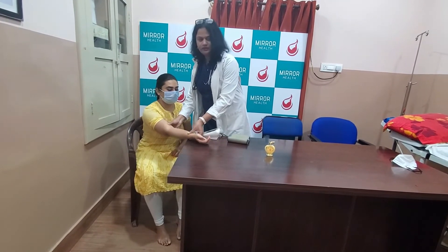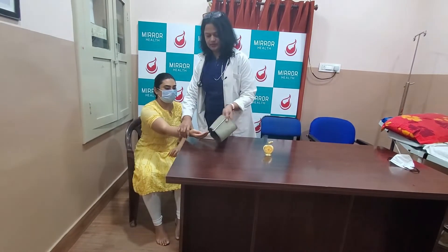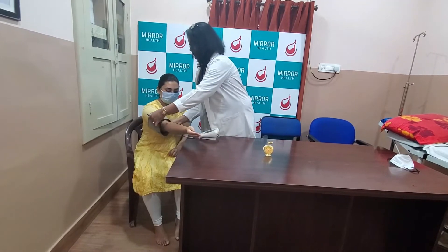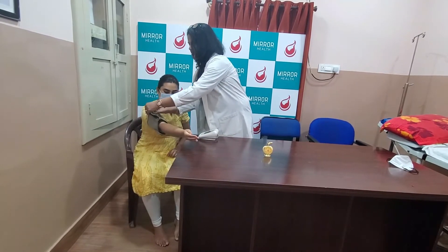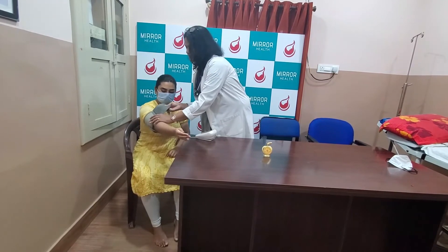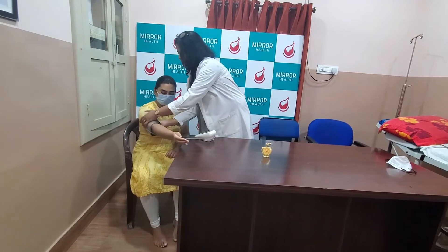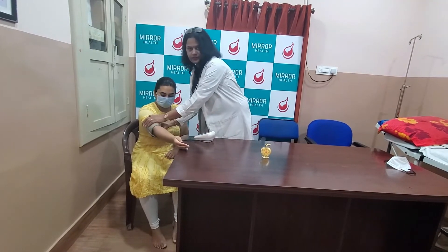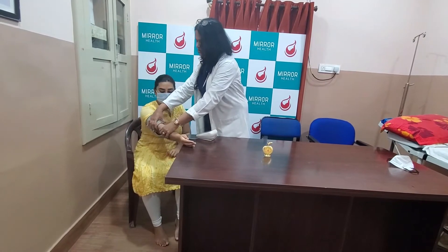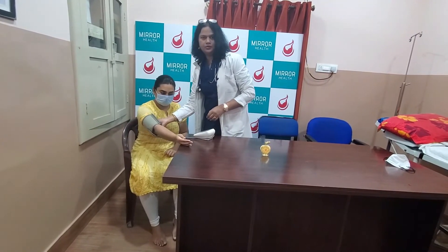I am going to make the arm rest on the table and I am going to insert this cuff in such a way that the bladder covers at least 80% of the arm and it is snugly tight. I have to make sure that the clothing is also properly placed so that it will not affect the fit of the cuff.